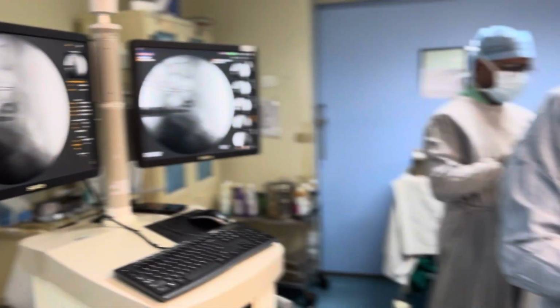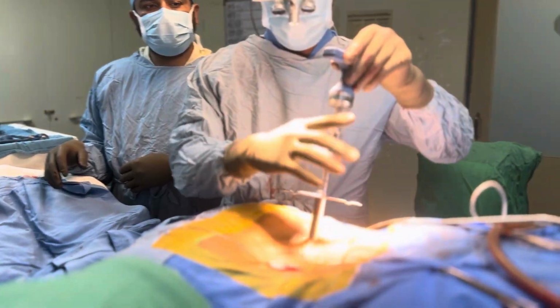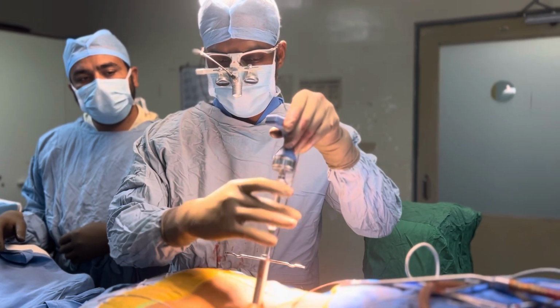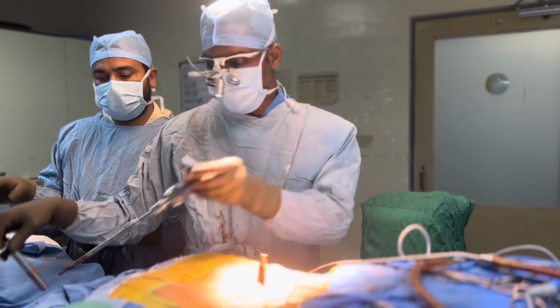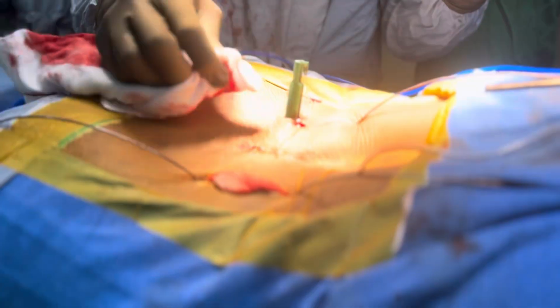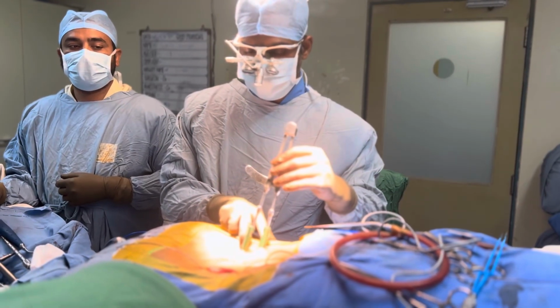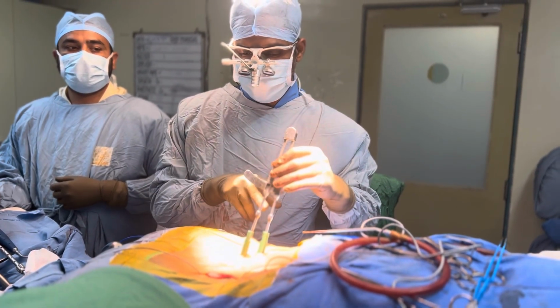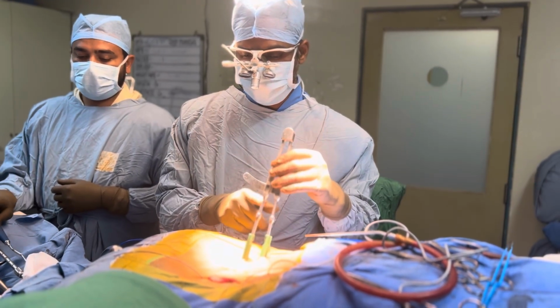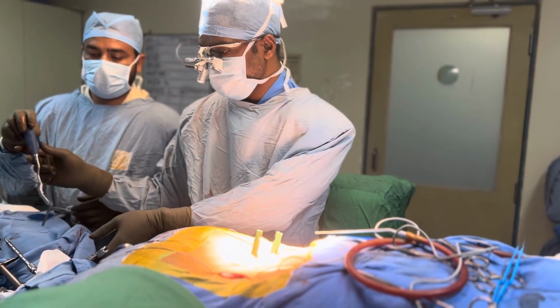So detach the handle of the screw and keep that sleeve of the screw in place for putting the rod. Now both screws are inserted on the left side. Guide wires are removed. This is an instrument on which you can measure the length of the rod, and accordingly you can take the rod.